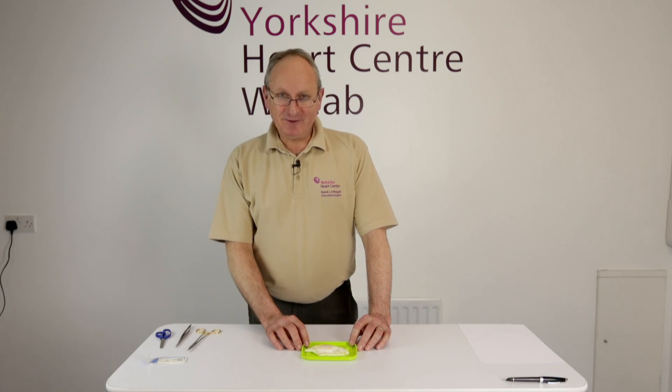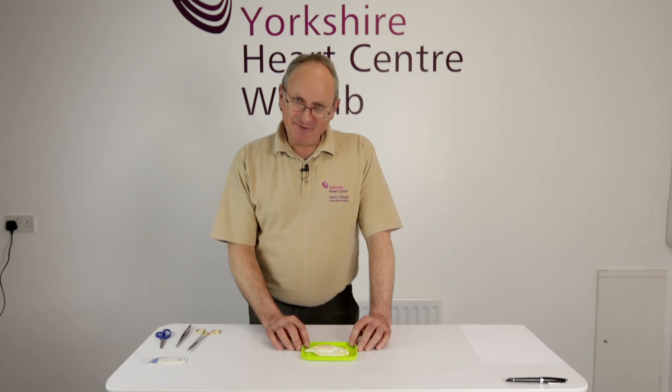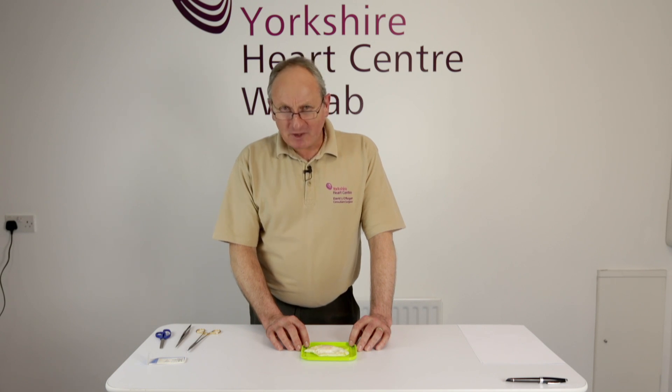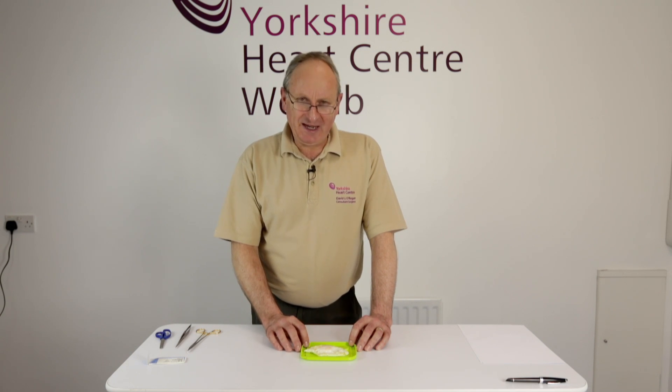Let me introduce you now to the poached egg. I know from experience that a 7-0 needle is jolly difficult to pick up and manipulate on a wet sticky surface. So I thought to myself, what do we have in the kitchen that could simulate a wet sticky surface? The poached egg came to mind.